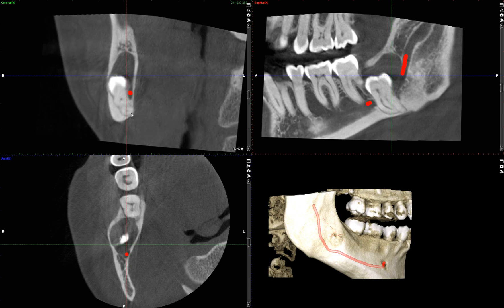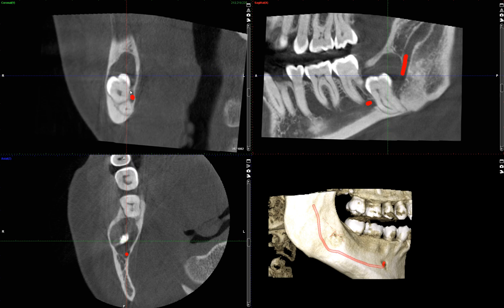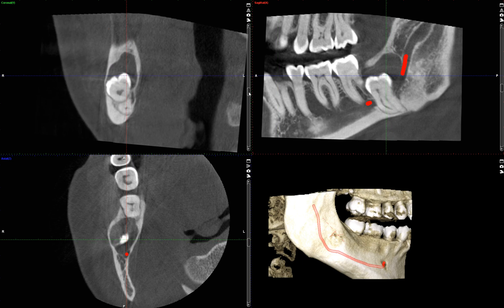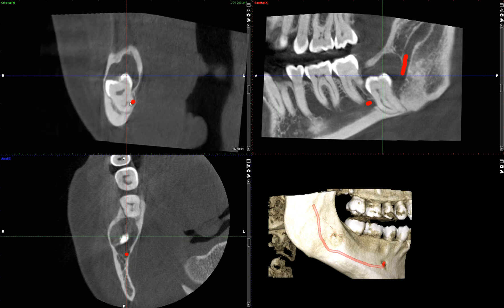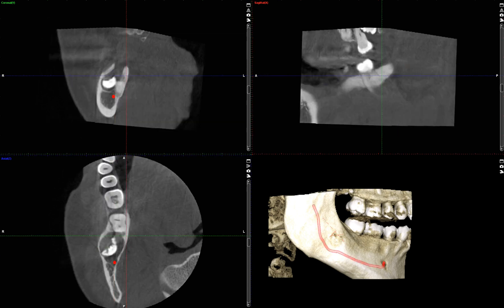This is what I mean by how thin the inferior cortex of the mandible is — the root apices are literally embedded into the cortex. As this canal continues coursing anteriorly, medial to tooth number 32, you can see it's constricted and very thin. Look at how thin the canal is. And you can see the canal loses its cortication at this point.